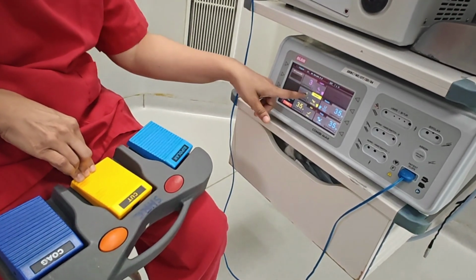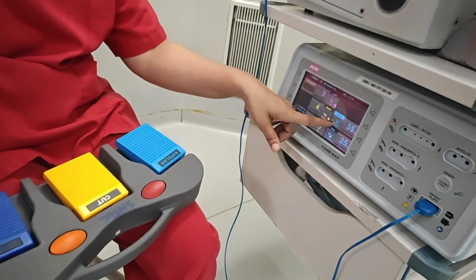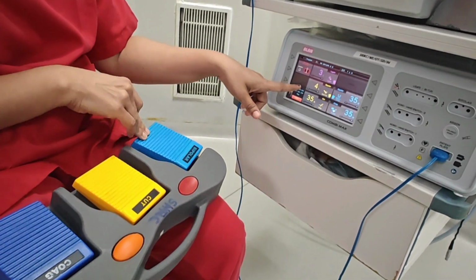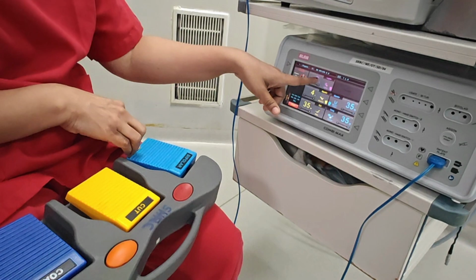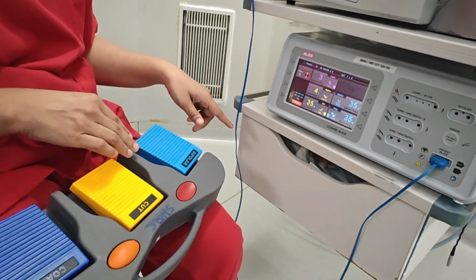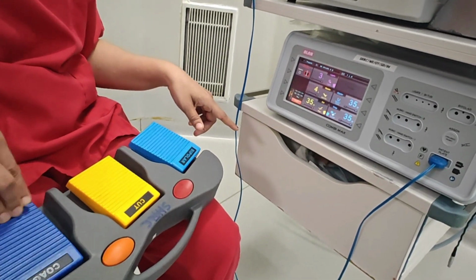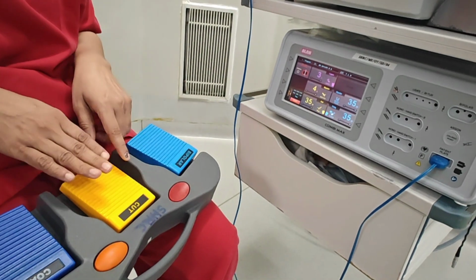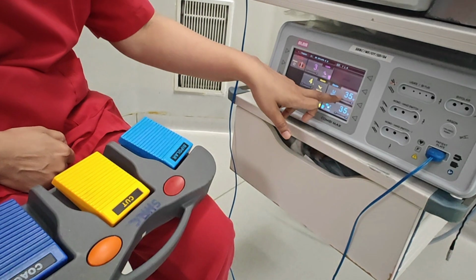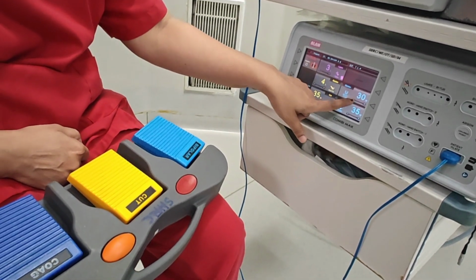So once I press the cut, that is the yellow, the mid button gets activated here, and if I press the coagulation button, then this coagulation is happening at 35. And if I am pressing the ligate, that is the bipolar, the ligate mode is on, which is at L3. If I shift over to monopolar, then the cut is not activated because the patient plate is not put, and if I put the patient plate, then it gets activated, and the lower 2 buttons will be activated if it is monopolar on the screen.